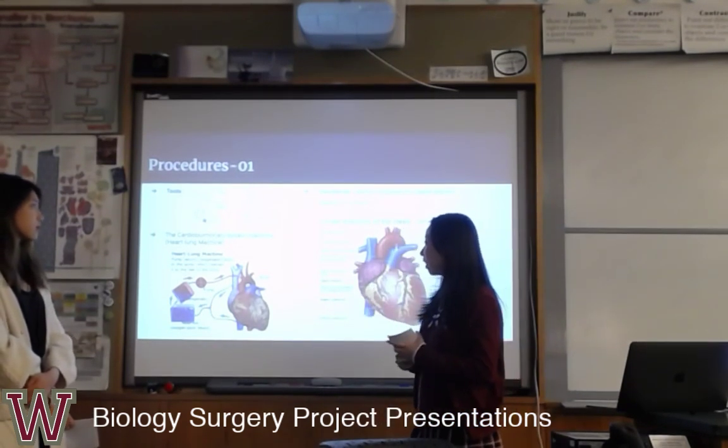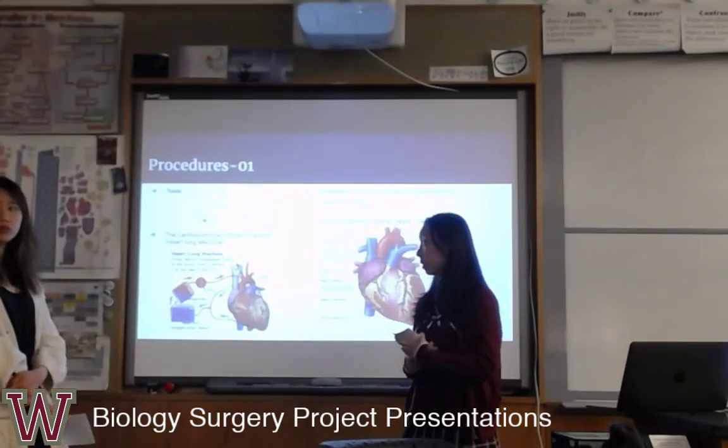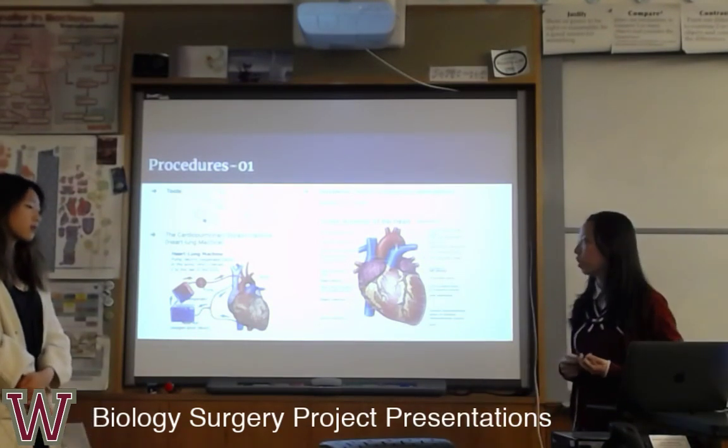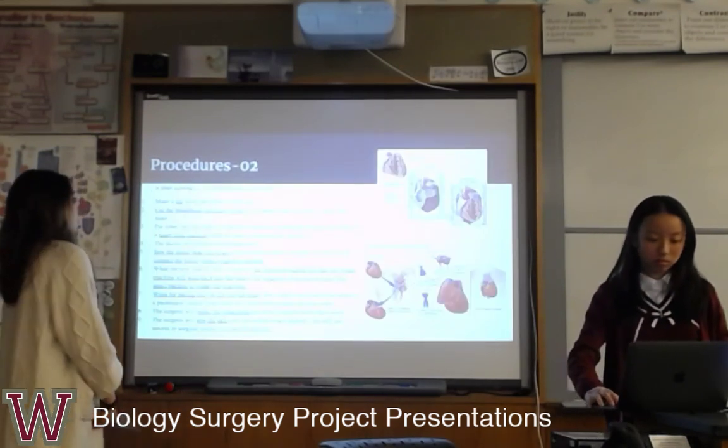The oxygen exchange is also done by this machine, so that you have oxygen to generate energy to support your life during the surgery.